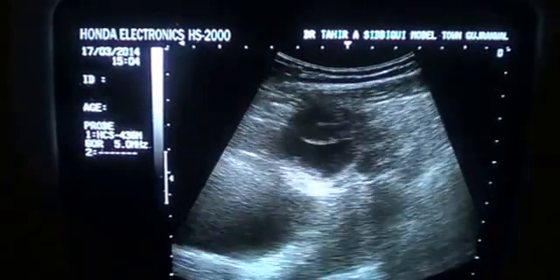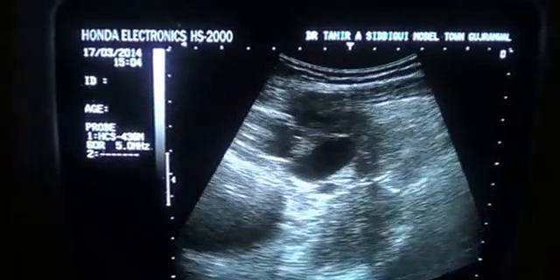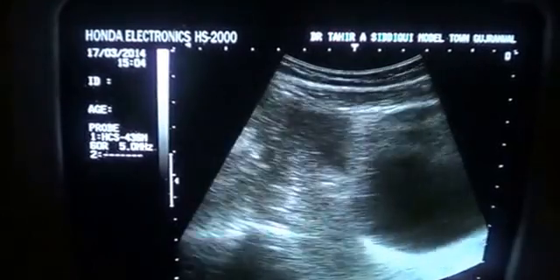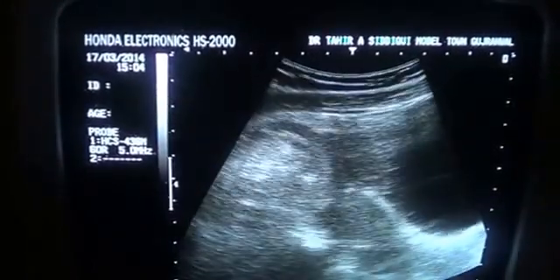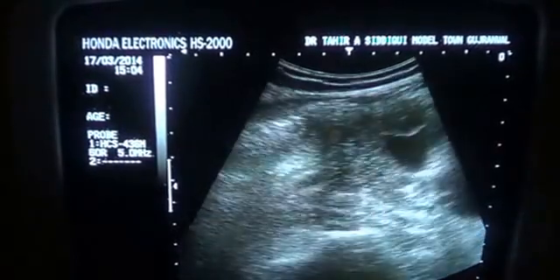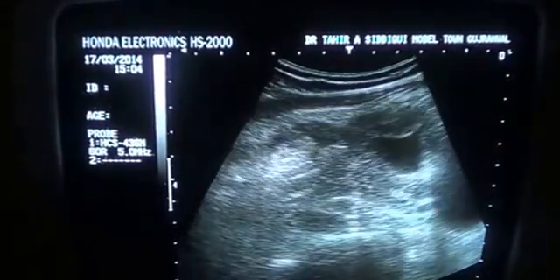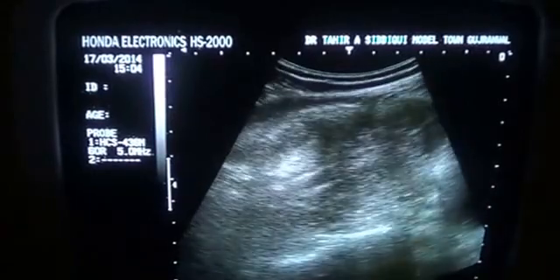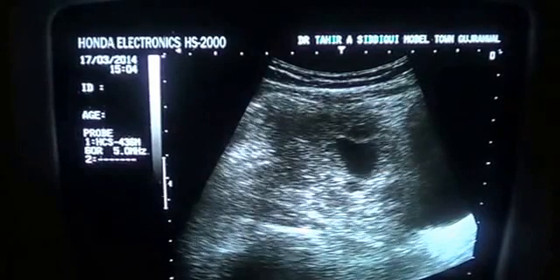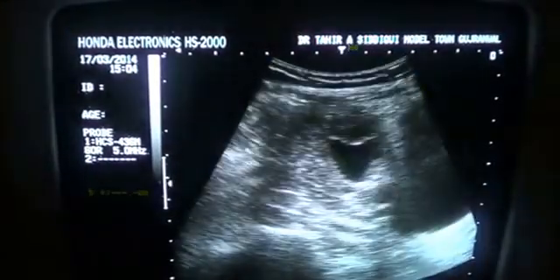This is the urinary bladder, a relatively hypoechoic area. This is the fundus of the uterus, and when I move the probe laterally, I see the internal iliac vessels.